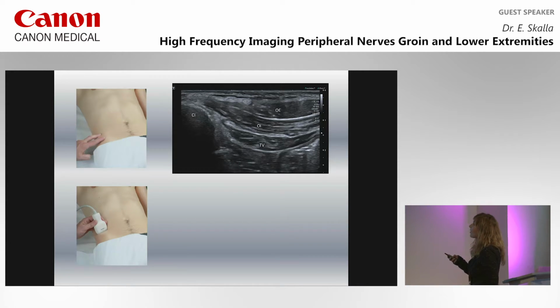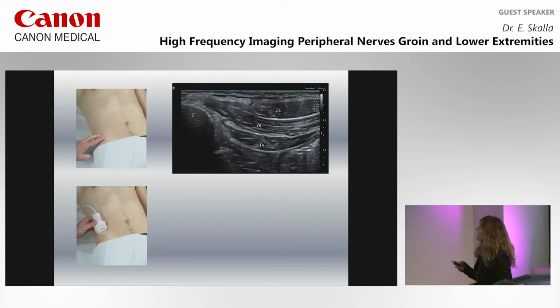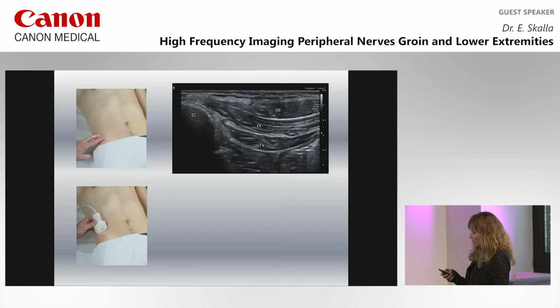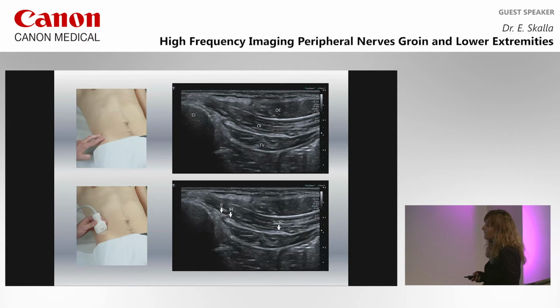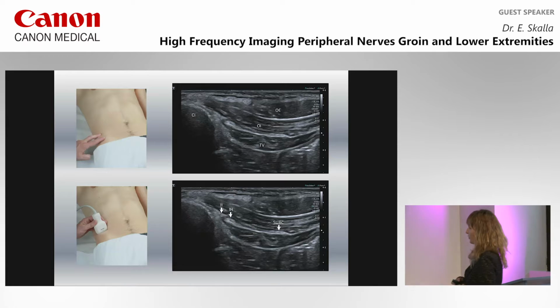This is the high echo from the iliac crest and the 3 layers of the abdominal wall. And they are important. The deepest one is the transverse abdominal muscle. Then we have the internal oblique and the external oblique muscle. And the space between the transverse and the internal oblique, this is the important space where we have to search for the nerves. And then you see here those tiny nerves in a cross-section area, the ilioinguinal nerve near the iliac crest, and in the direct neighborhood, the iliohypogastric nerve. We could also see in this layer the subcostal nerve.